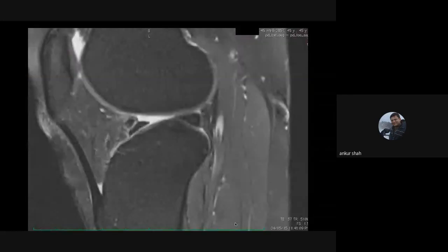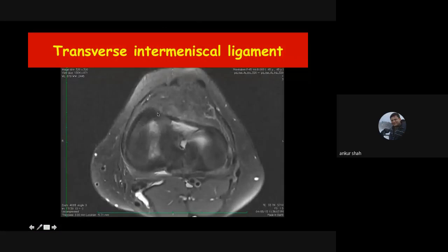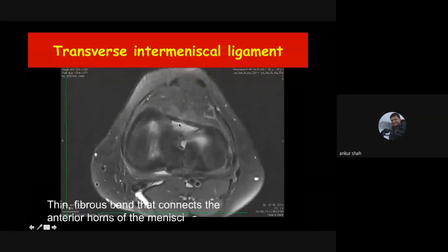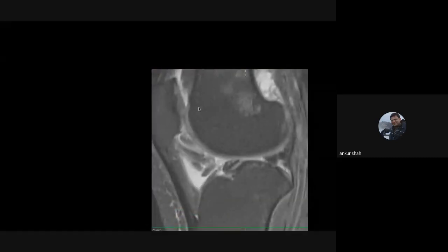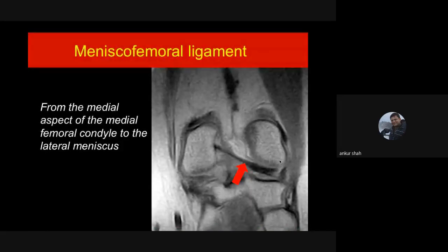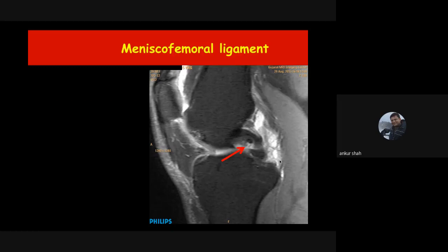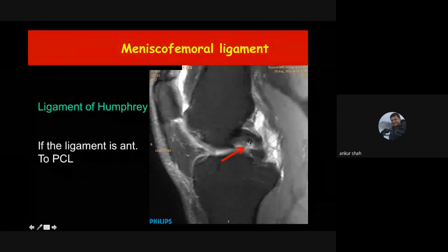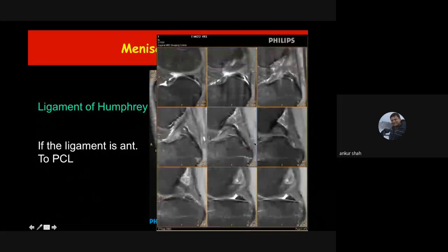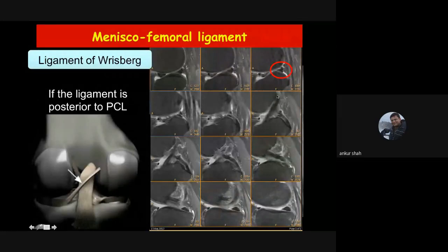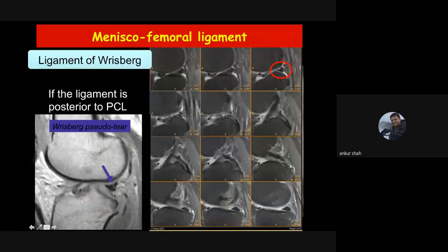Certain ligaments can mimic meniscal tears. A structure that looks like a tear of the anterior horn of the meniscus may actually be the transverse intermeniscal ligament — connecting the anterior horn of the medial and lateral meniscus. Similarly, posteriorly there can be a ligament that looks like a posterior horn tear but is actually the meniscofemoral ligament, which has two components: the ligament of Humphrey (traversing anterior to the PCL) and the ligament of Wrisberg (traversing posterior to the PCL).